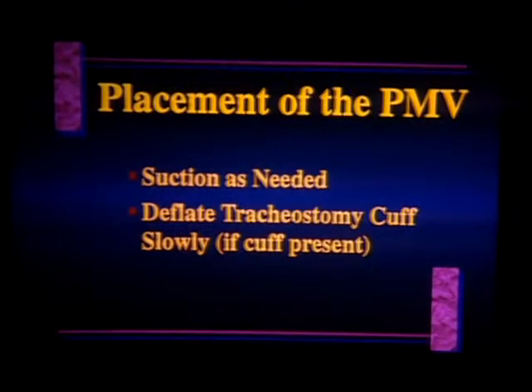You want to suction the child as needed. In pediatrics, I think maybe I get a little used to suctioning large quantities of secretions, but we don't seem to have some of the same issues because secretion quantities are just smaller. Sometimes we suction more frequently because when they do occur, respiratory distress is common, and they need to be suctioned right away. So suctioning every half hour is not particularly unusual in kids. You want to deflate the tracheostomy cuff if it is present, which most of the time it is not.